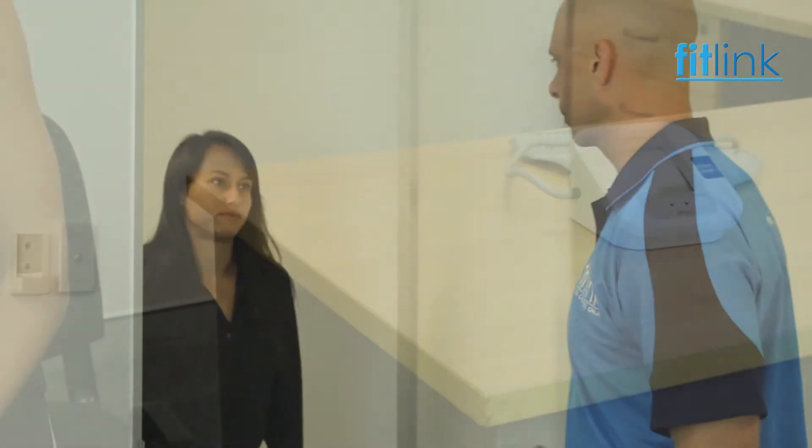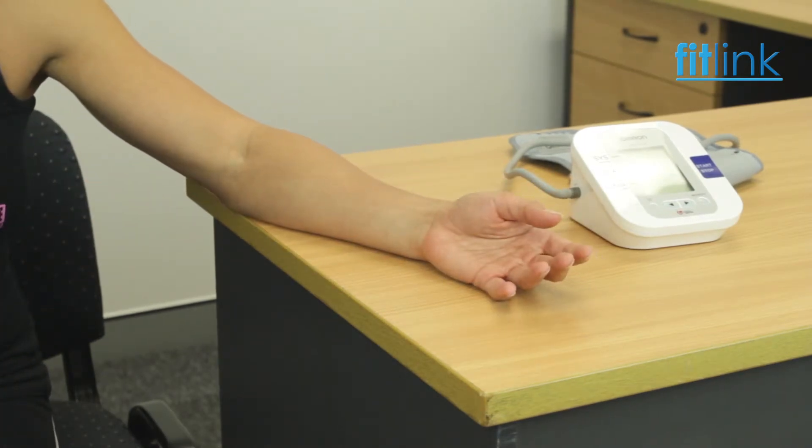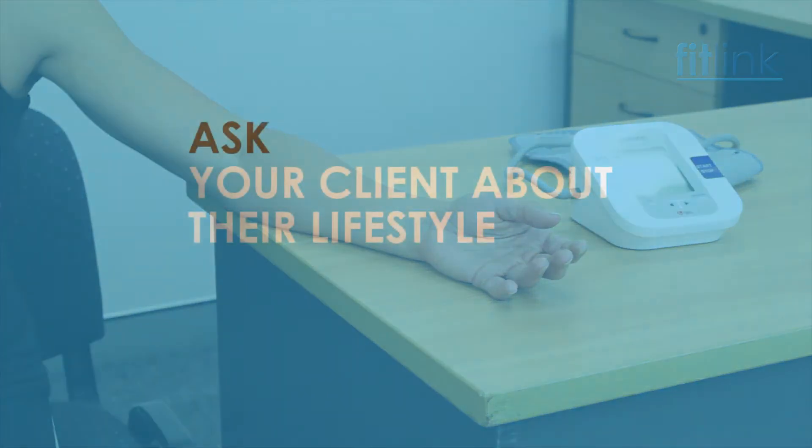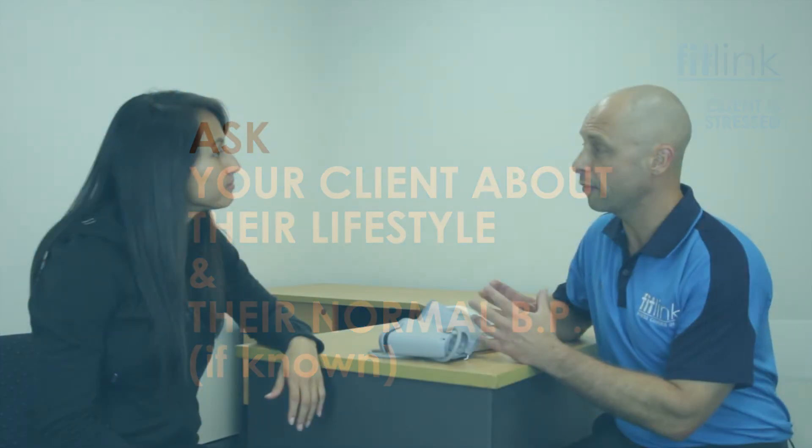When assessing the client's blood pressure, have your client seated in a comfortable chair with their left arm resting on a table or solid surface, and the upper arm at heart level. It's not ideal to take the client's blood pressure when they are stressed, have consumed caffeine, or used a tobacco product in the past 30 minutes.